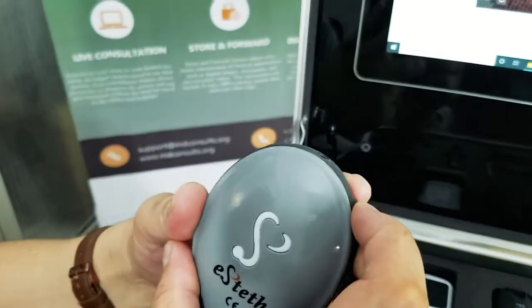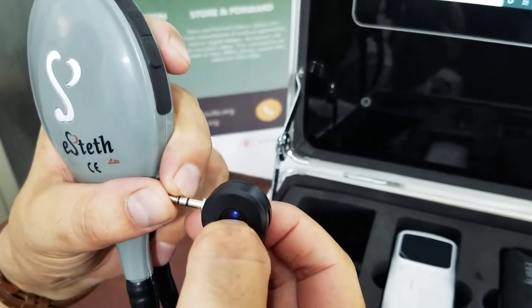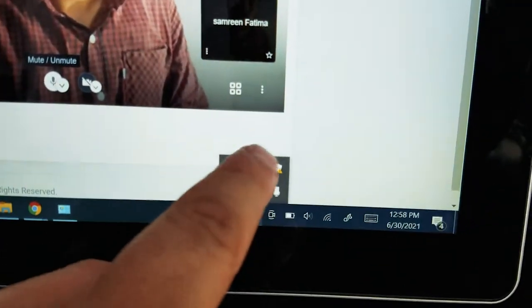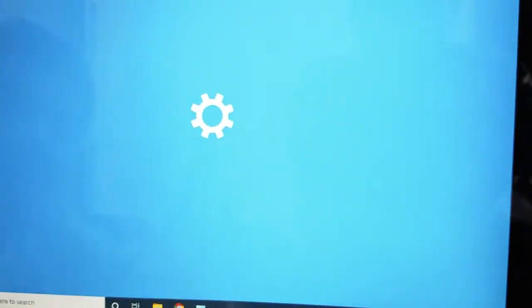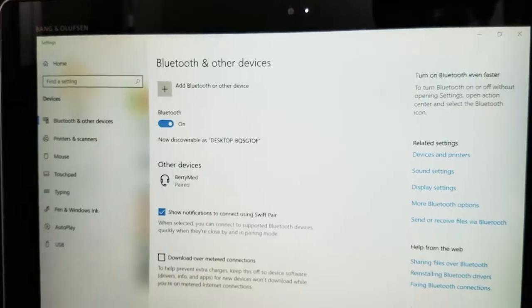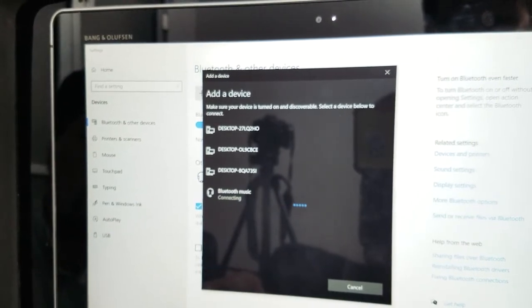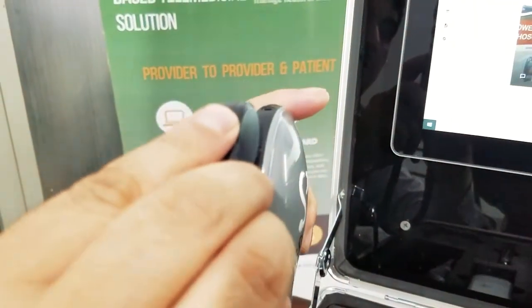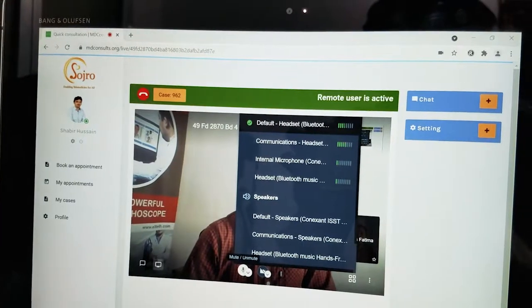Your digital stethoscope can also be connected via Bluetooth. You can put the Bluetooth adapter in the side Aux cable slot where the Aux wire was connected, and also turn on the Bluetooth on your tablet. Select the right Bluetooth device. Now when the stethoscope is placed on the patient's chest, the sounds can easily be transmitted.